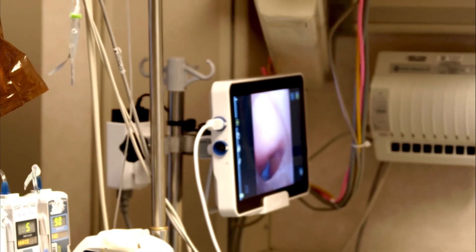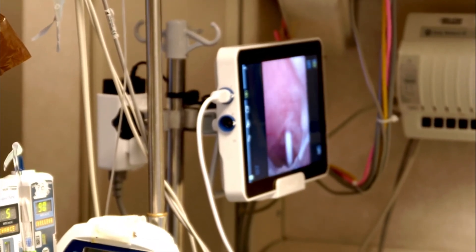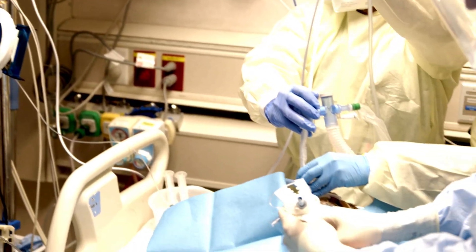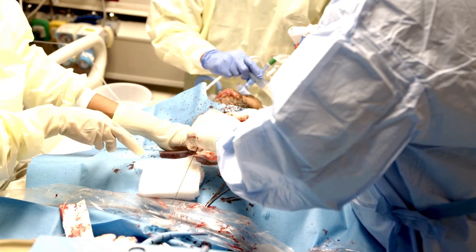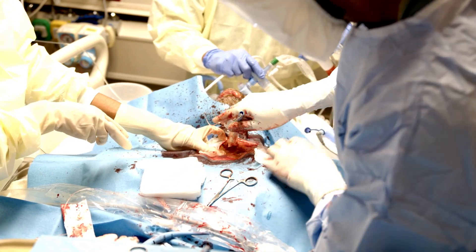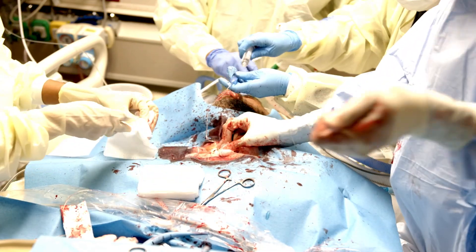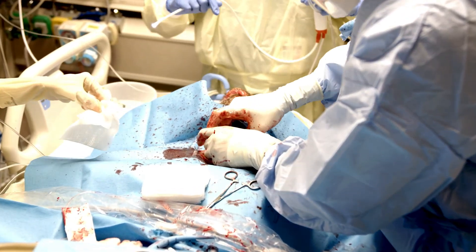Now I'm going to dilate all the way to the skin level just once — that's enough. Pull out and keep the wire and white catheter in the trachea. You have your size 8 cuffed Shiley here. Go ahead and advance the tracheostomy tube over the dilator — give a little push — there it goes. Remove the wire and dilator and connect to the ventilator after securing. And that's it.